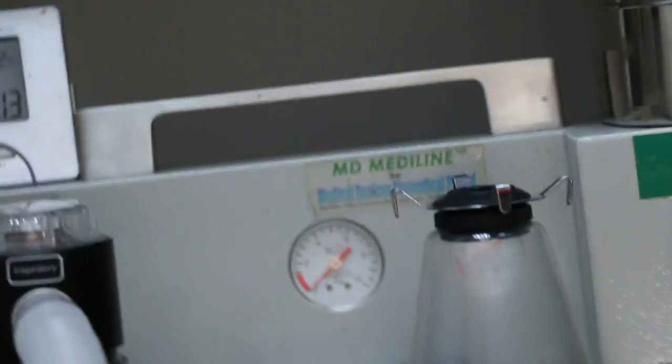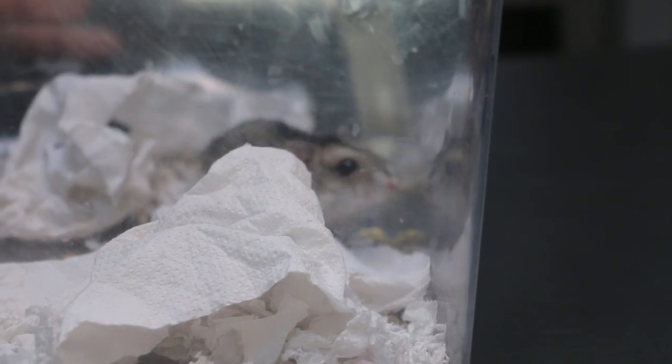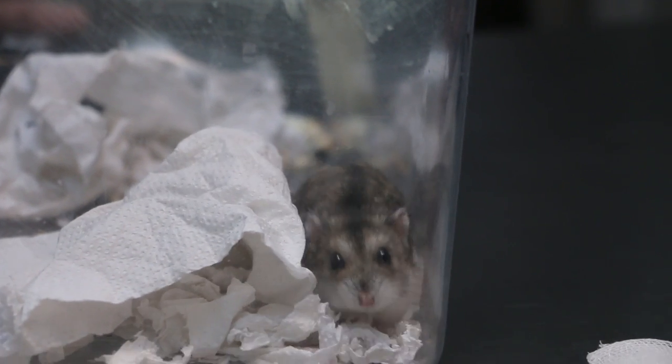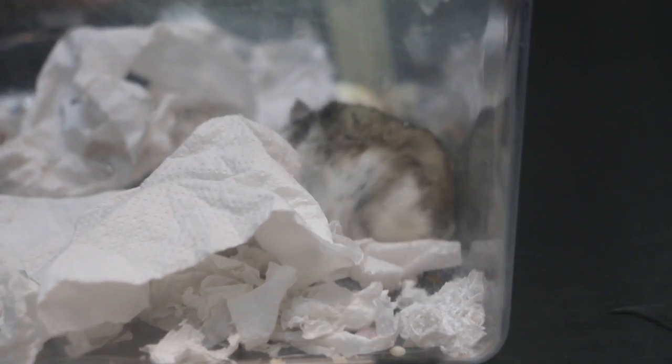And where was the injection? About 2 minutes ago, the area has been clipped. Okay, so ready. Is it sleeping now? No. I need only one drop, so it might not sleep. Not sleep, then we need the gas. No need. Yes, because this one is just excising the wart completely on one leg. Then the other leg, try and excise it as well.